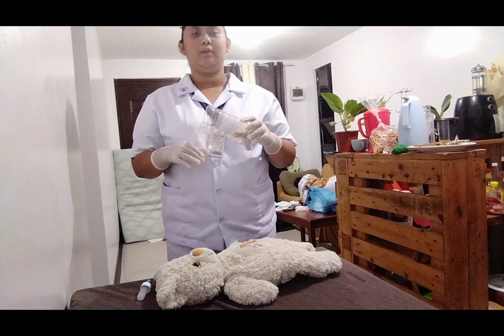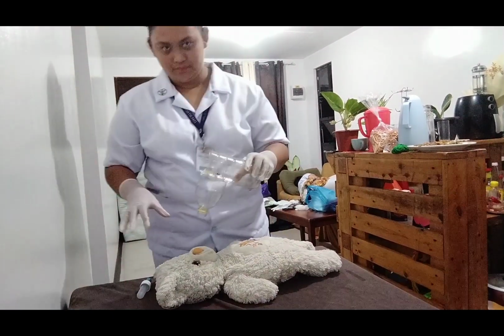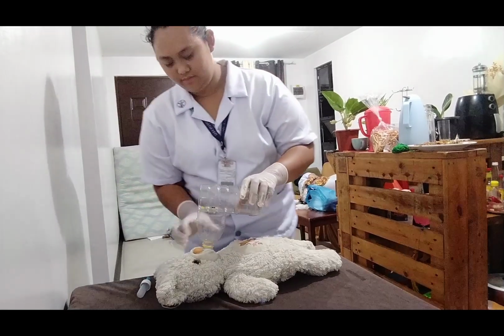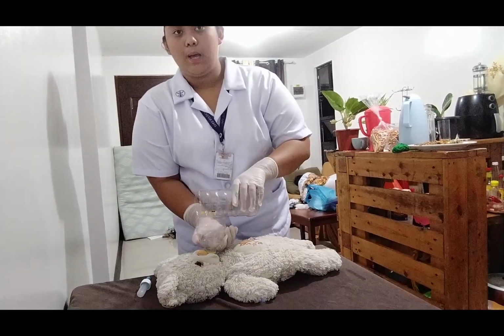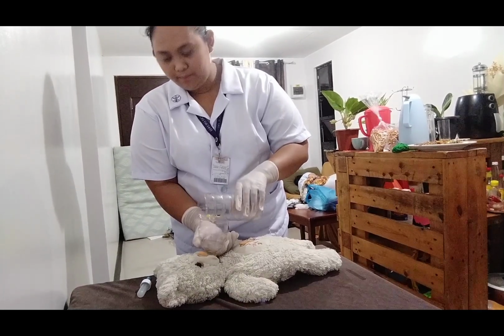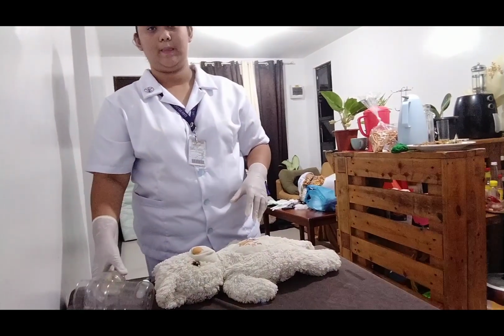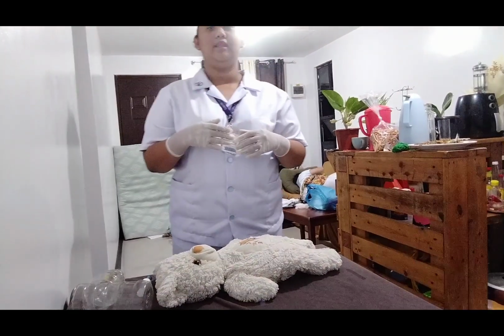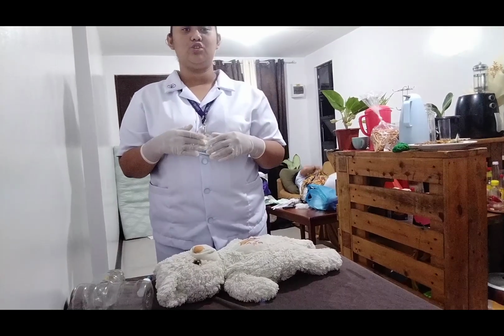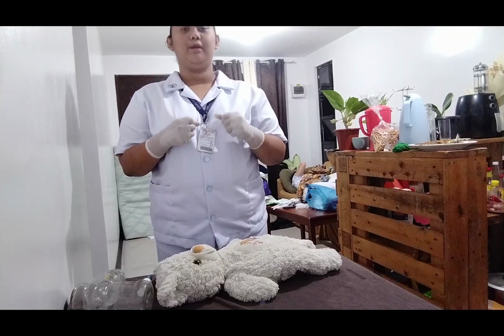Be sure to maintain the proper positioning. So what we're going to do is breathe, 2, 3, breathe, 2, 3. Breathe, 2, 3. PPV should be done for 30 seconds, at 40 to 60 breaths per minute.